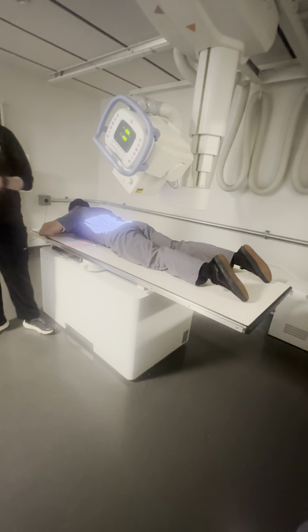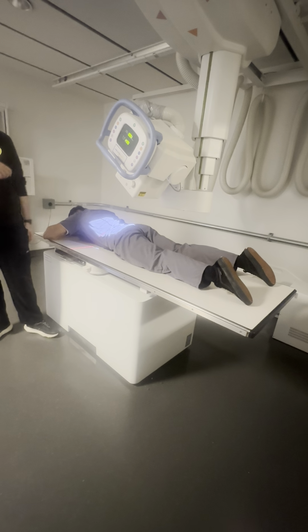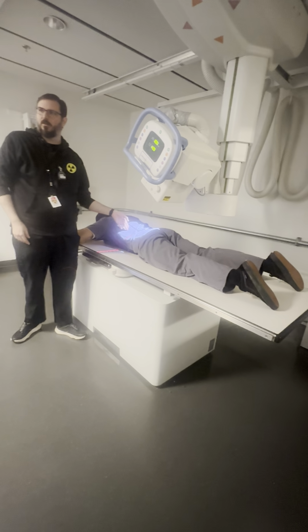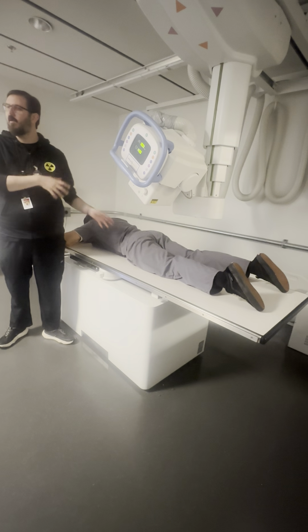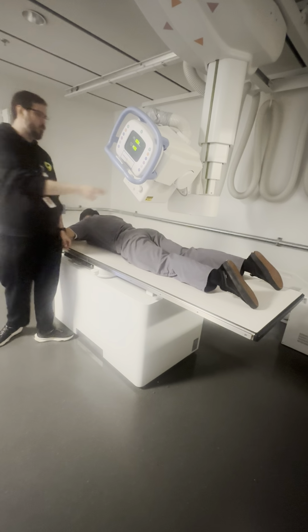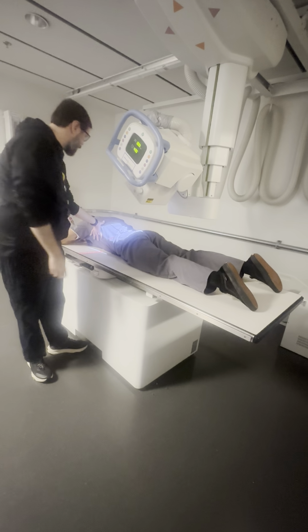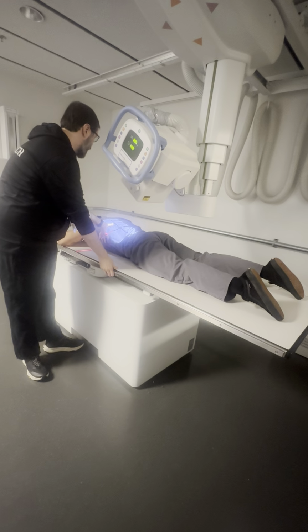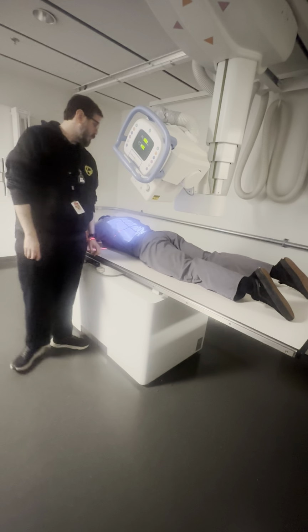Kind of like we did, what was the other one we did that for? The femur or something like that, right? Yeah. We were using that trick. Yeah. Same idea here: you put the marker there and you just cut through your marker again. That way you're not searching for your position all over again, right? So right there. Right there. Good. Shoot there.